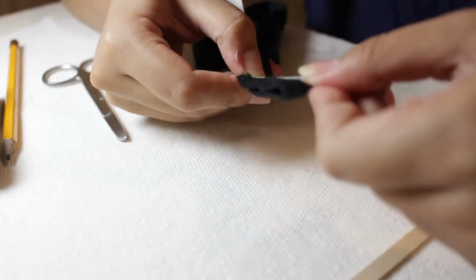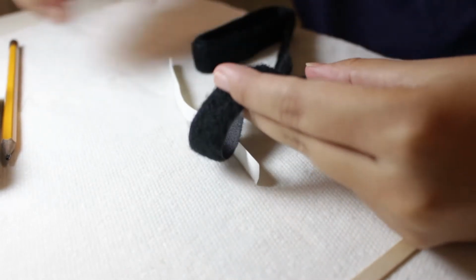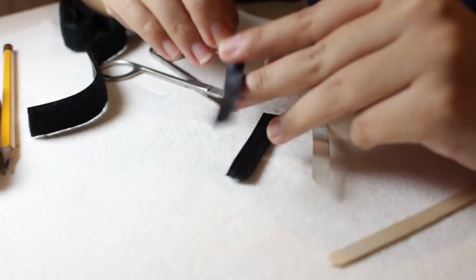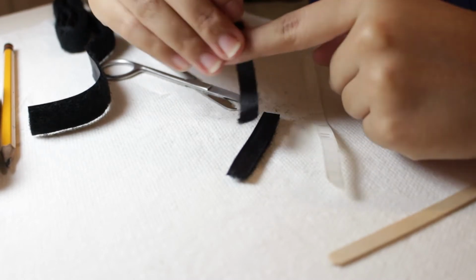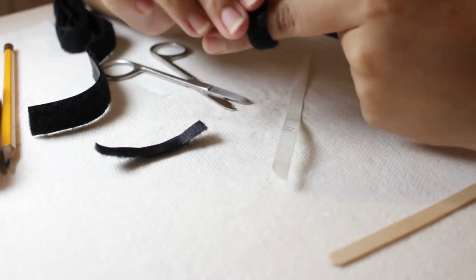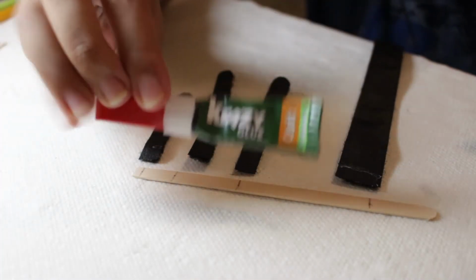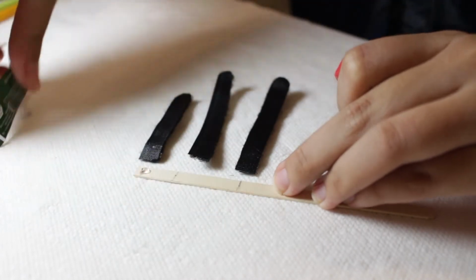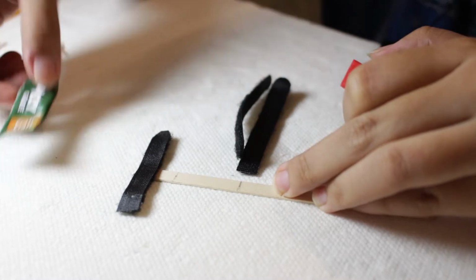Next, measure a piece of soft Velcro for each landmark and add about a 1/4 inch of allowance. Cut the Velcro pieces in half lengthwise for each finger strap. Check to see if each finger strap fits perfectly. Next, using glue, we will be gluing the center of the Velcro, fuzzy side face down, on the marked popsicle sticks.